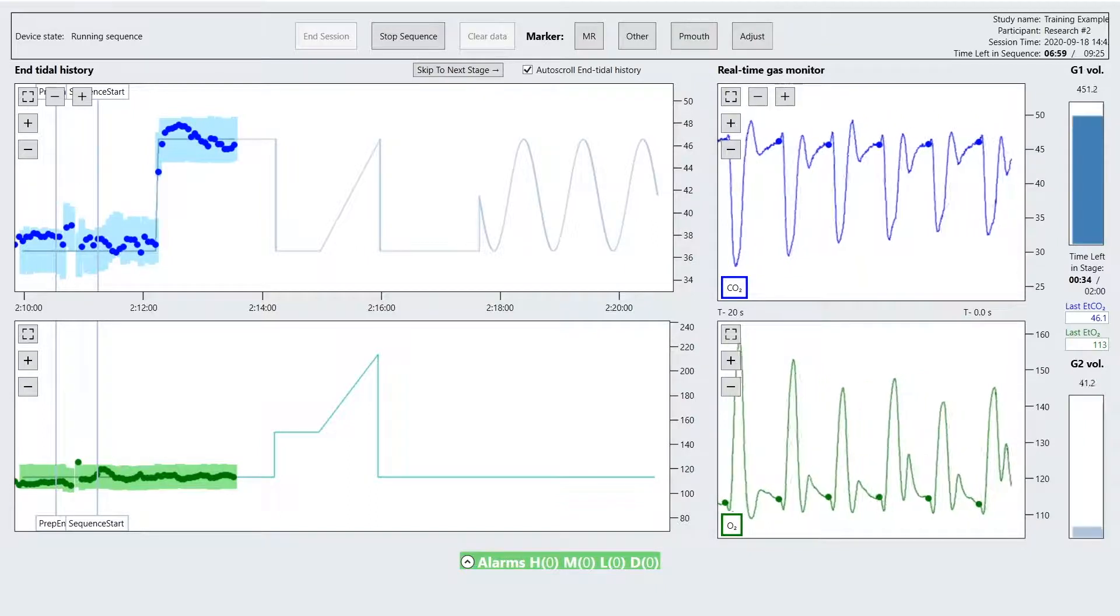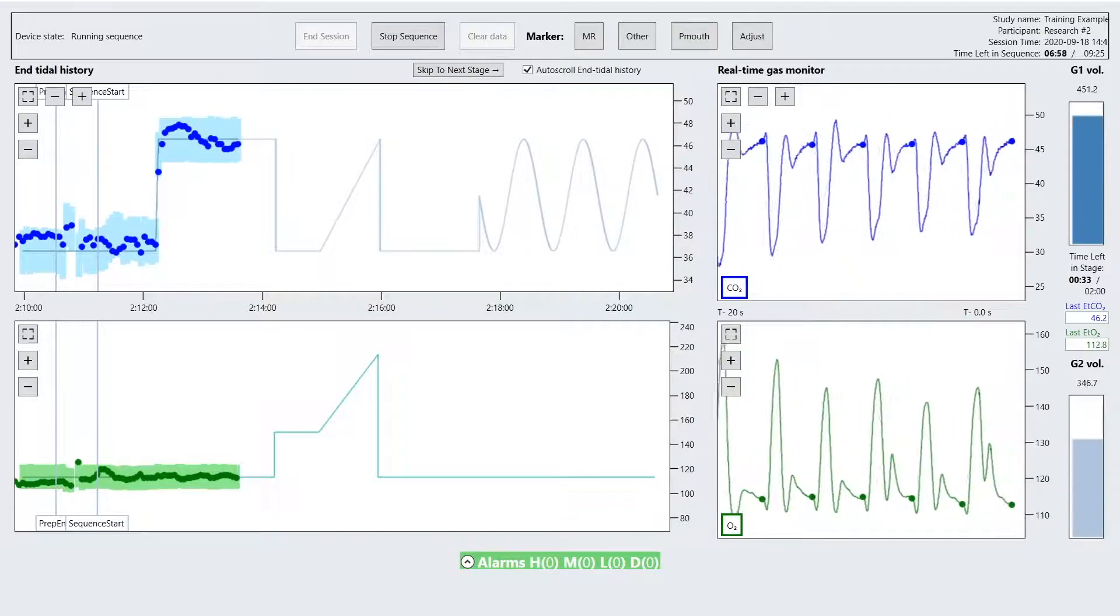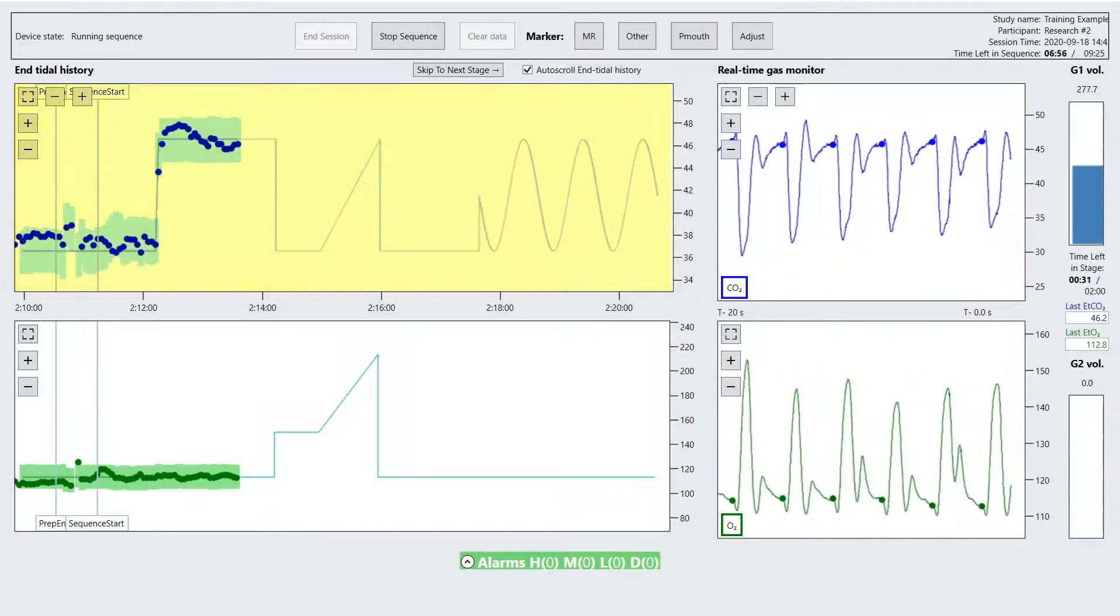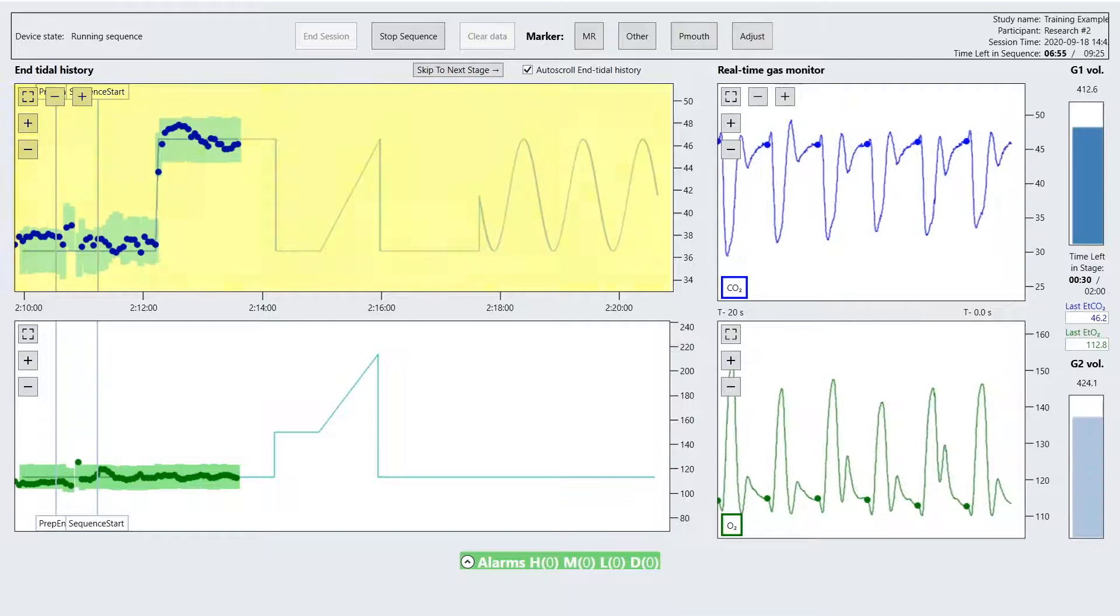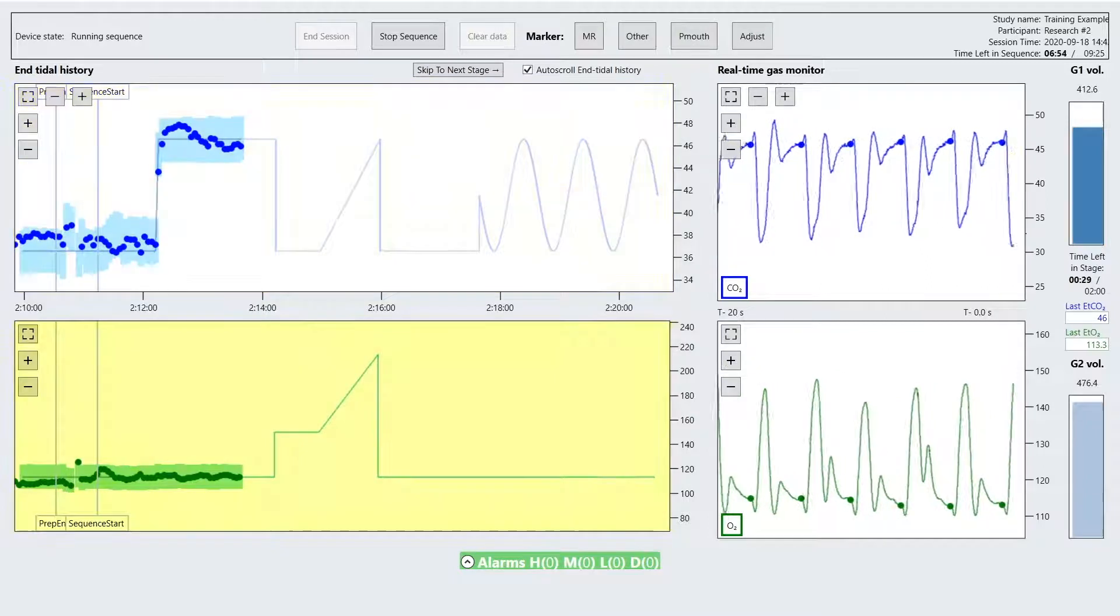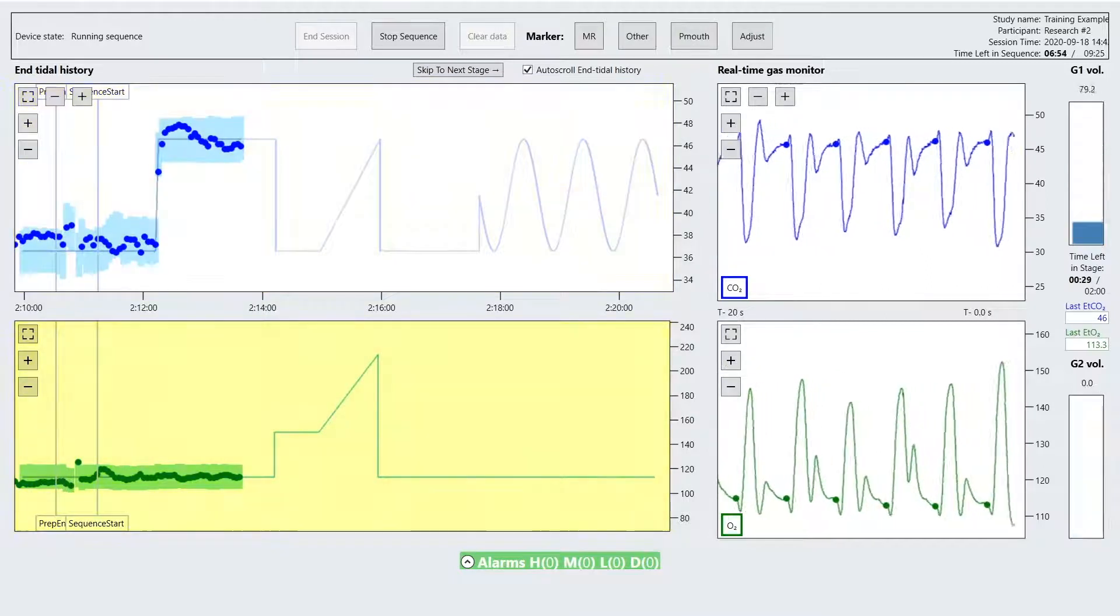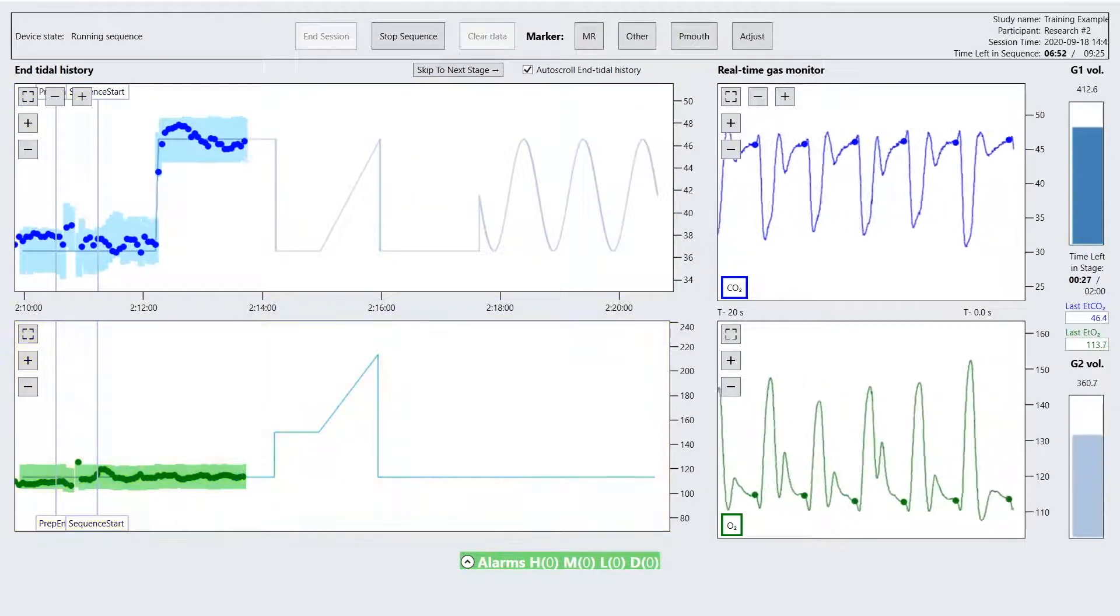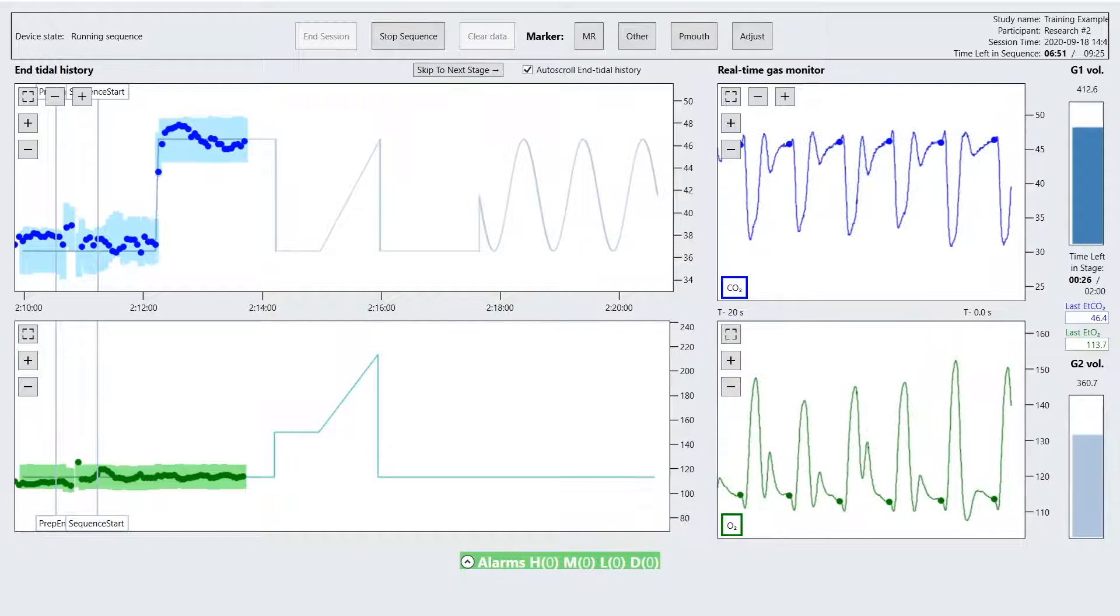The end-tidal history displays the series of values for end-tidal pCO2 displayed in blue and end-tidal pO2 displayed in green, updated after every breath.